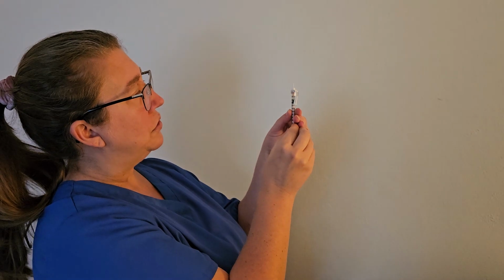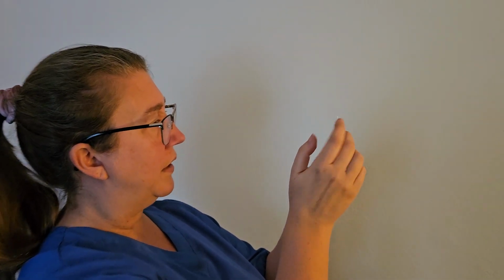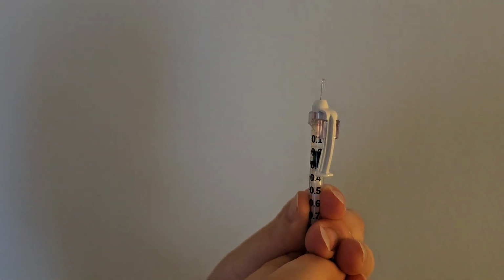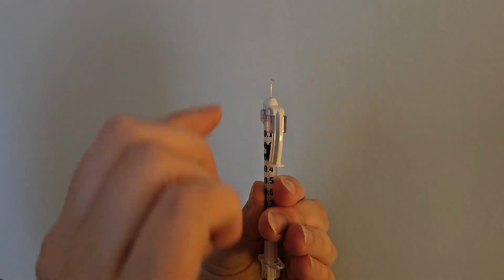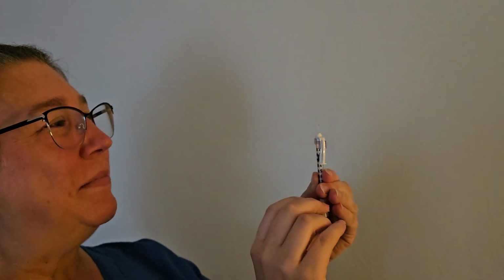and we are going to check and see if we have any air bubbles, and push our plunger up until we get one tiny bit of medication in the bevel.